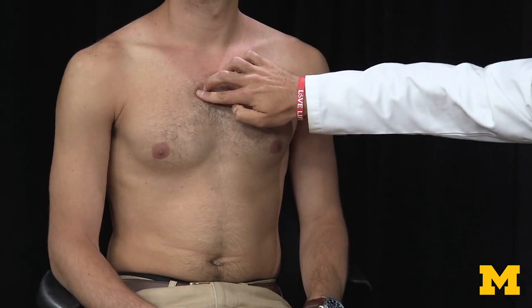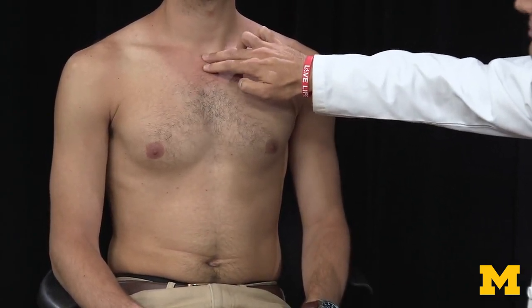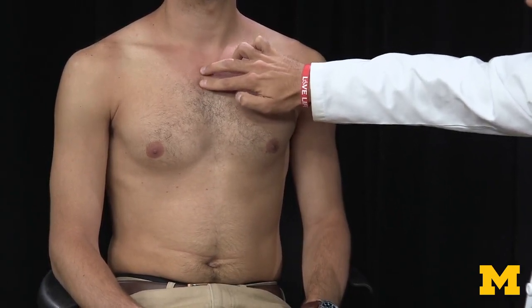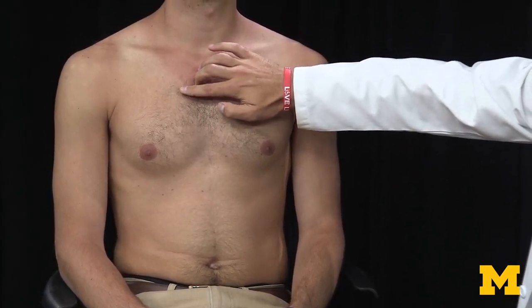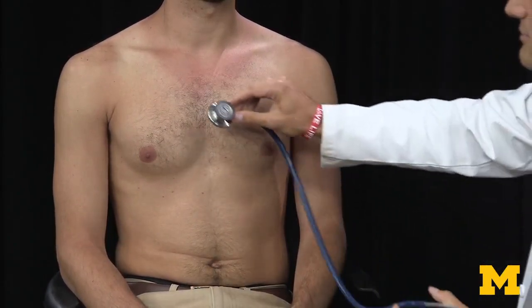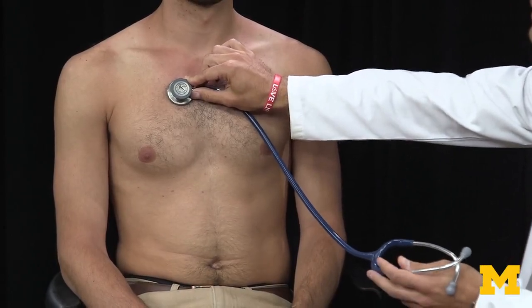Using the mnemonic A-P-T-M, we start with the aortic valve, located at the second intercostal space on the right sternal border. I find it by locating the jugular notch at the top of the manubrium, traveling down to the sternal angle — where the manubrium meets the body of the sternum — then moving immediately to the patient's right. The aortic valve closes at the end of systole, so the S2 will be stronger: lub-DUB, lub-DUB.